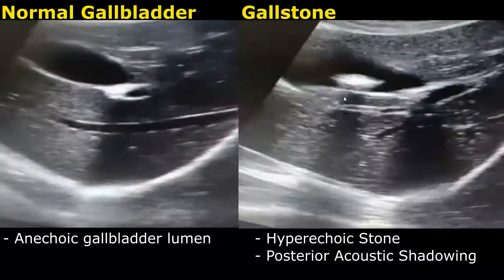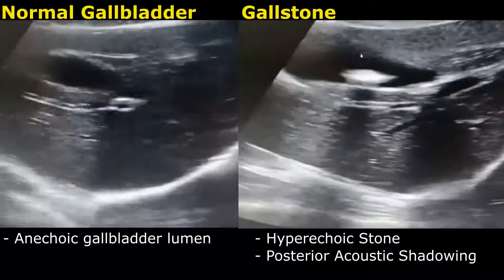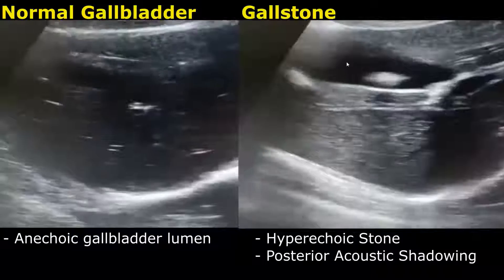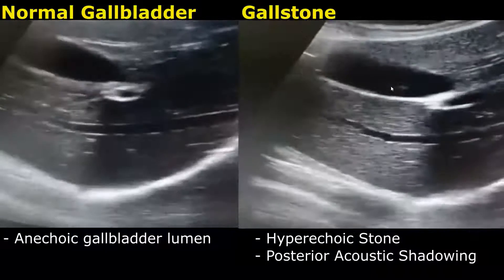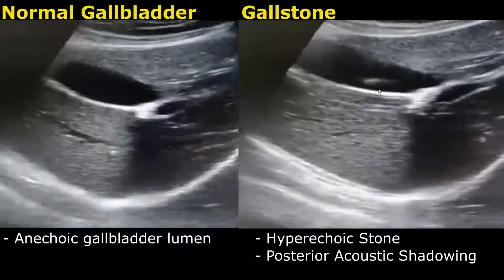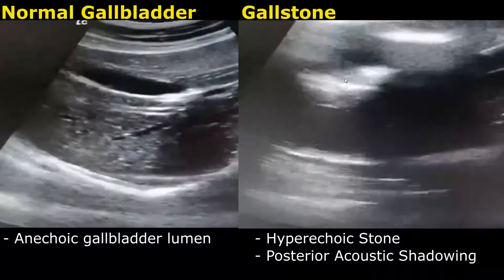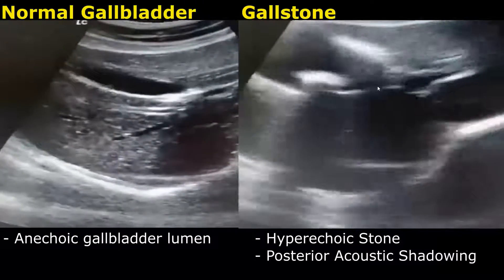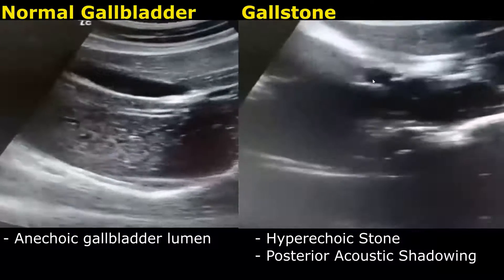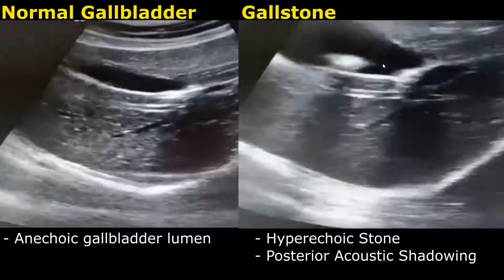The gallbladder is distended. The gallstone seems to be in the body and is separate from the neck of the gallbladder.